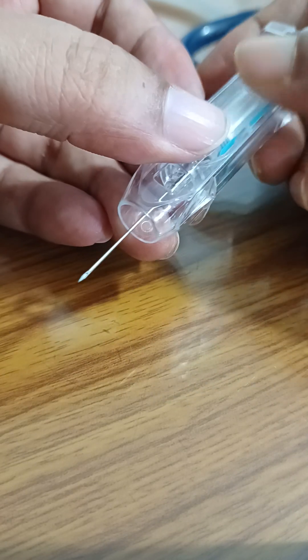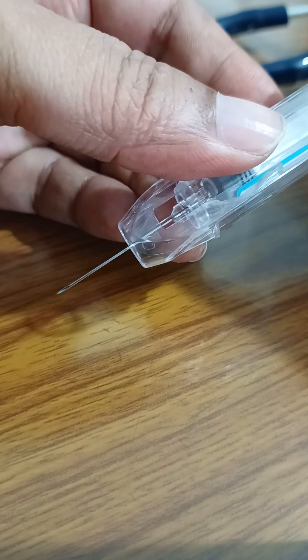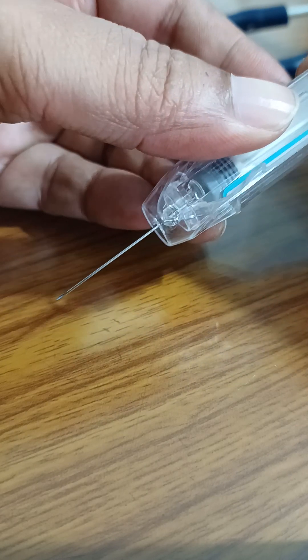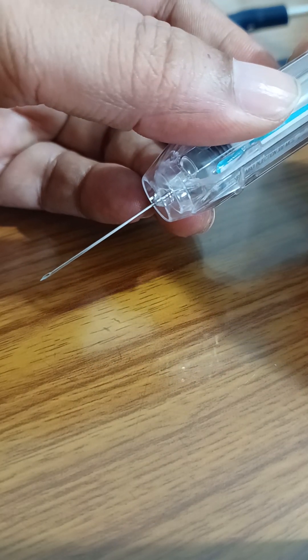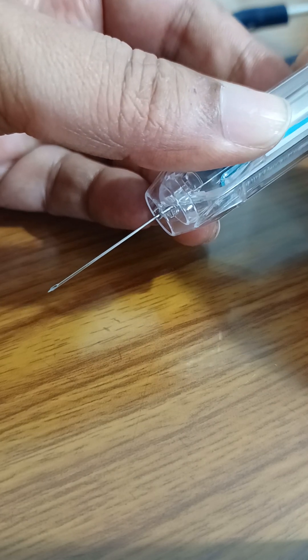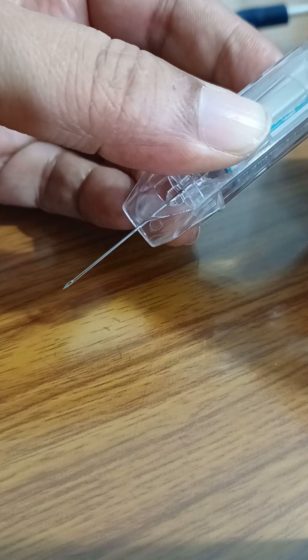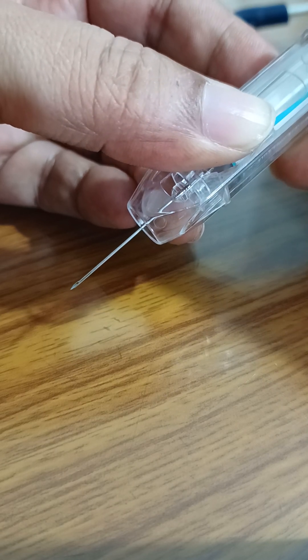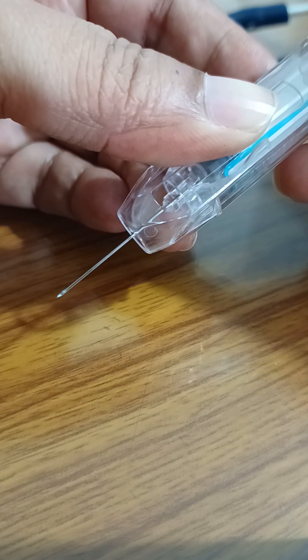For a thin patient, the needle size should be small, and for a larger patient, the needle size should be longer. We simply pull out to reduce the length of the needle.